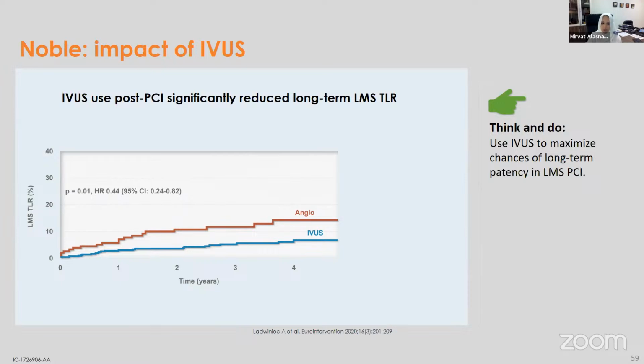However, when they did a sub-study and published it on IVUS, what you do see is that target lesion revascularization was significantly higher in the angio alone versus IVUS guided PCI. And so that is significant. And it warrants pause that maybe we should be looking at or redesigning left main trials that actually look at IVUS guided PCI compared with CABG, rather than angio alone compared with CABG.